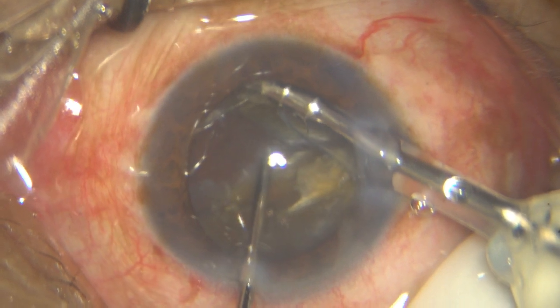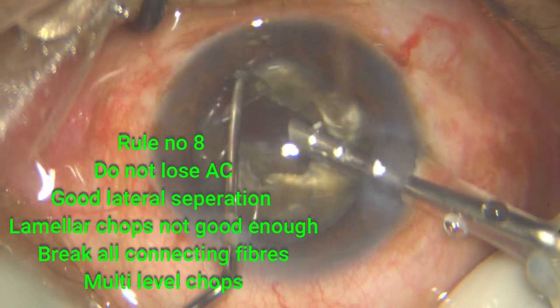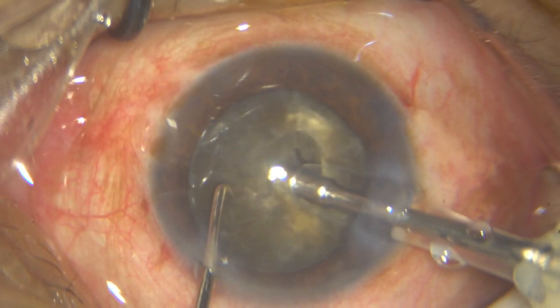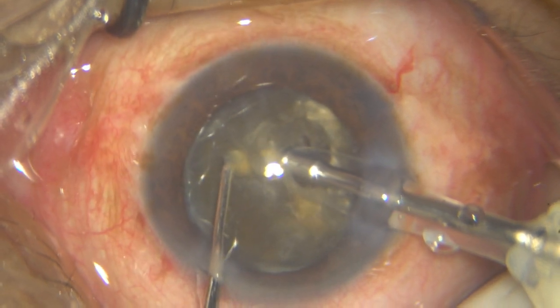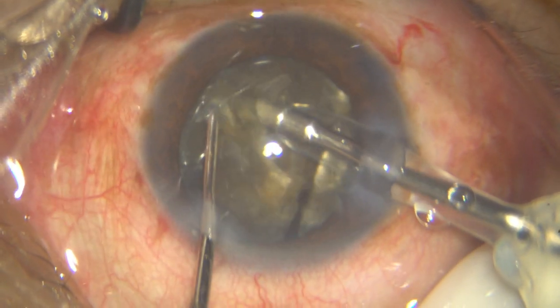If needed, go at multi-levels. Look how I have gone to a multi-level and broken it up. Do not make lamellar chops. Try your best to avoid that. Do not keep losing the AC. Do not keep coming out of the AC, because if your pupil shuts down on you, you are going to have a lot of problems to complete the case.